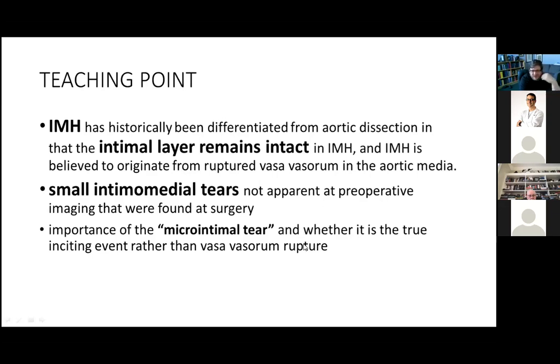Now, the thought of this has changed recently, and really this has been the prevailing thought because we haven't been able to appreciate intimal disruption in IMH. But more and more, I've actually seen this more than one time, where I've operated on those patients with pure IMH, and you don't actually see a dissection on imaging preoperatively, but you go in there and you do see an intimal tear.